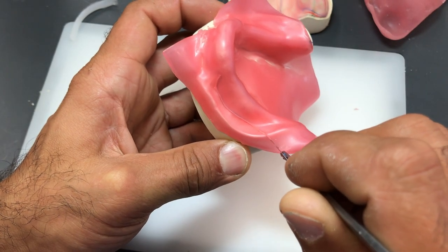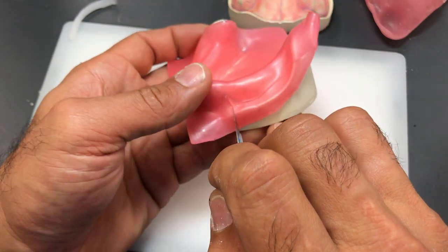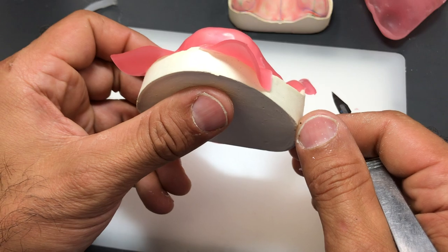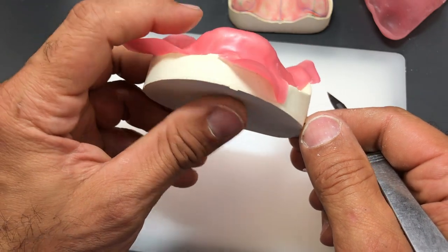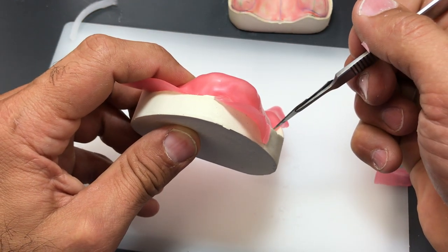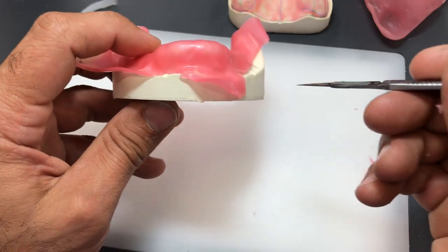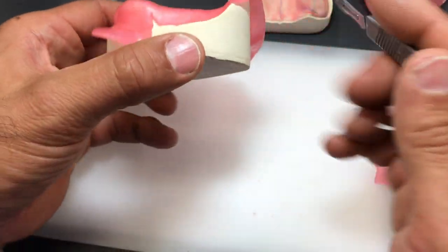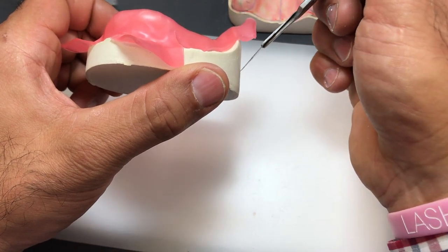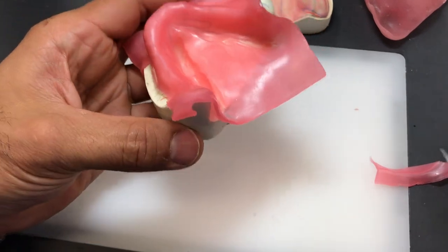What does that mean? So I'm going to cut a little section here and I'll show you guys. So I'll peel this section out. Notice that the wax is cut at right angles to the surface of the cast. So my blade approached at this angle. I didn't go in too steep or too shallow. I am at right angles. If I use this model surface for a second, just to prove a point, if I'm cutting to this surface, I'm at right angles to the surface. I'm not angled one way or another. So I'm going to continue that throughout.